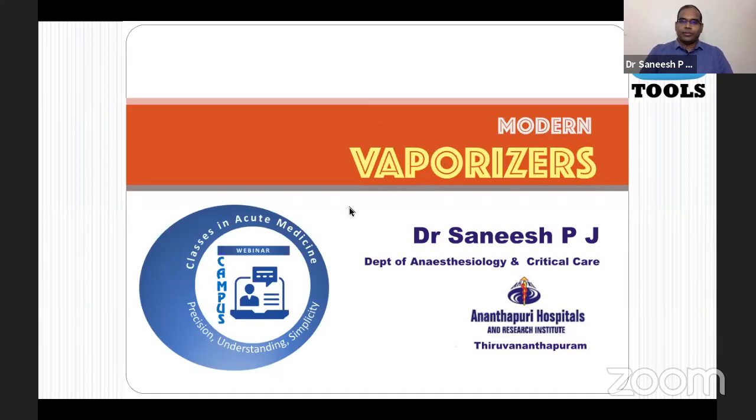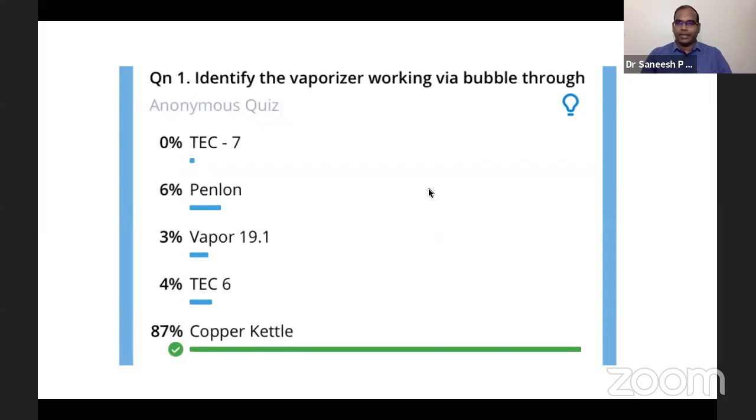Okay, so to begin with, something on our pretest, and even the last week's pretest answers, we were not happy with the statistics. Maybe because there is a famous saying about this topic, vaporizers, that this is a vaporizing topic. You study, you believe you know, but after some time, you tend to get confused. So luckily for the first question, there is not much confusion. Identify the vaporizer working via bubble through principle. Tec 7, Penlon, Vapor 19.1, Tec 6, copper kettle: 87% went with copper kettle. We'll discuss the answers a little later.